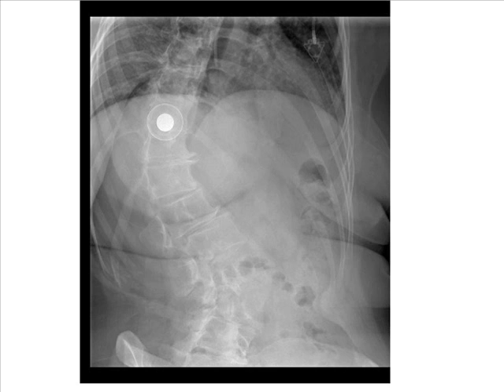Ribs 1 through 9 should be included and seen above the diaphragm, and ribs 8 through 12 should be seen below the diaphragm. The axillary portion of the ribs should be free of superimposition.